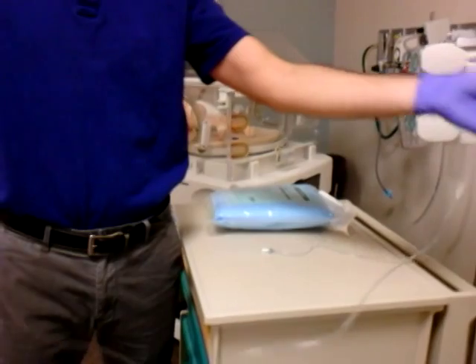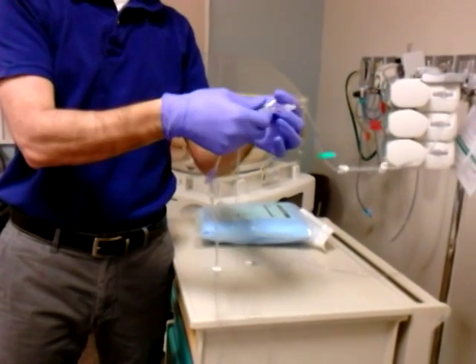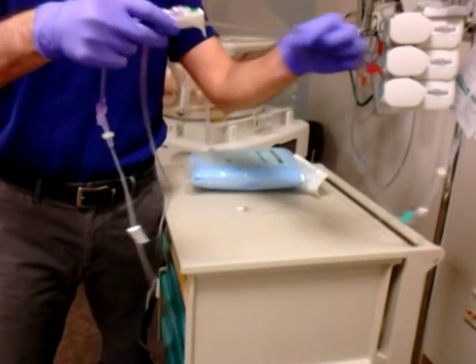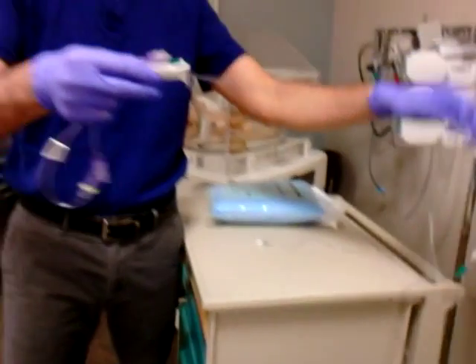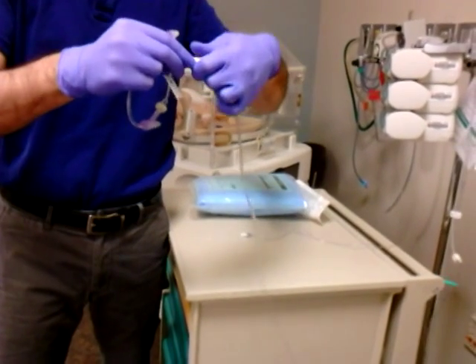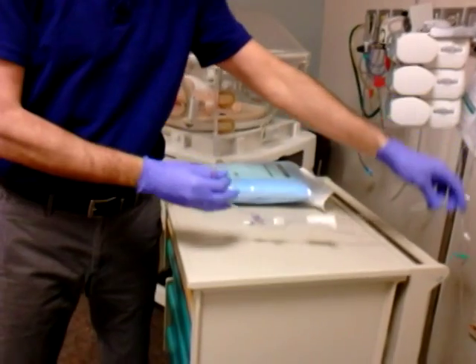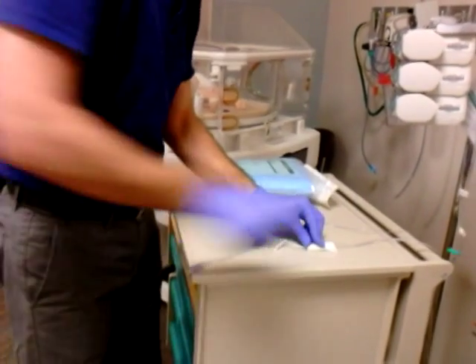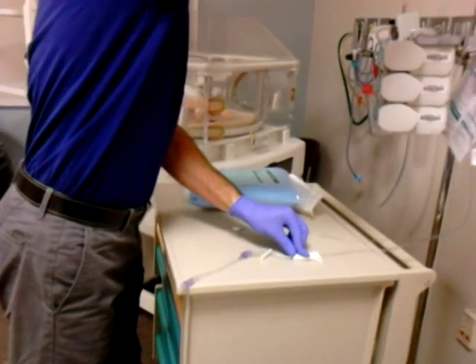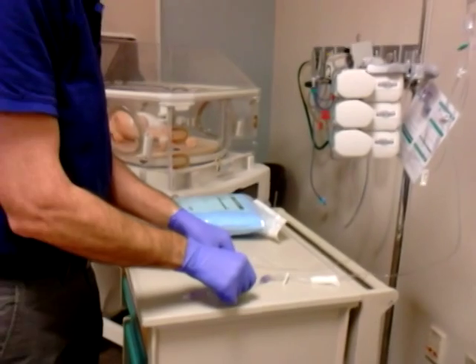Your IV tubing will come from pharmacy as it always has, with your TPN and your lipids already spiked. You want to make sure that you move the roller clamp down as far as you can towards the end of the tubing to make this procedure a little bit easier. Then place both of those, after you've primed them, on the edge of your work surface and loop the extra tubing up over your IV pole.